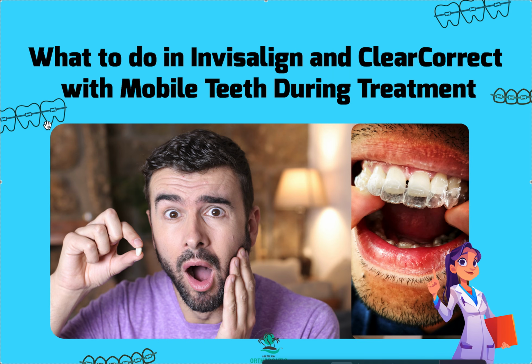And then that's another thing you need to talk to your patient about: what does that look like? What happens if we stop the treatment at, let's say, there was 50 aligners and we stopped at 35? We never finished, okay? Just couldn't, without losing things. So if that honestly happens, you need to explain to the patient, are they getting a refund? Because in their mind, they're probably thinking, hey, I was 2/3 the way through treatment, I'm getting a 1/3 refund.